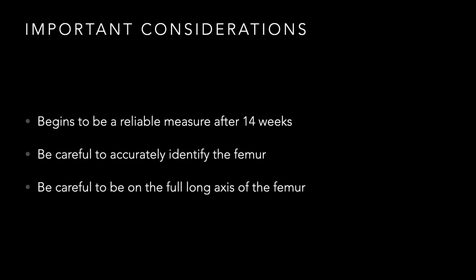But you need to be careful you identify the full length of the femur, and even just the femur itself, right? There's multiple long bones that are developing inside that fetus. And I've seen, on occasion, that the humerus gets measured inadvertently in place of the femur. And so you really want to be careful that you are accurately identifying the femur and not some other long bone, so you can get that accurate assessment for the femur length.